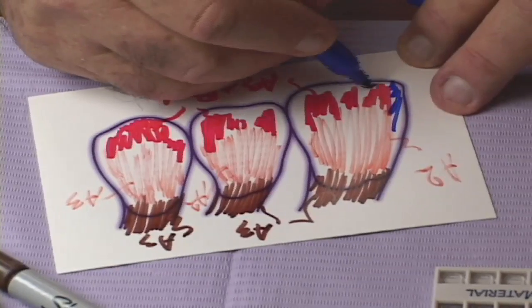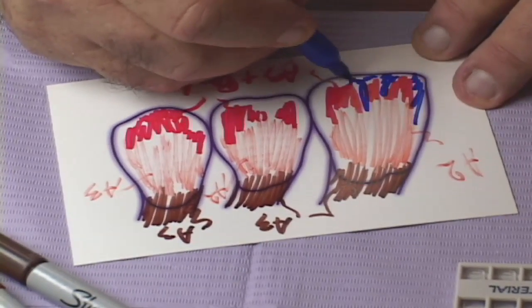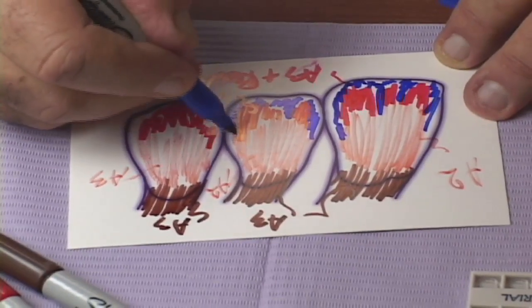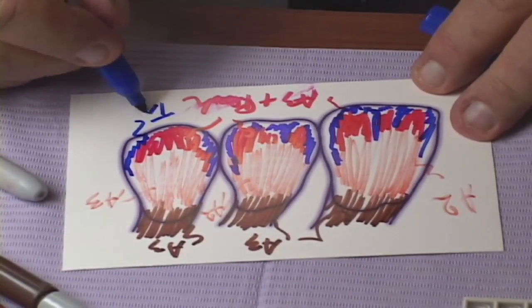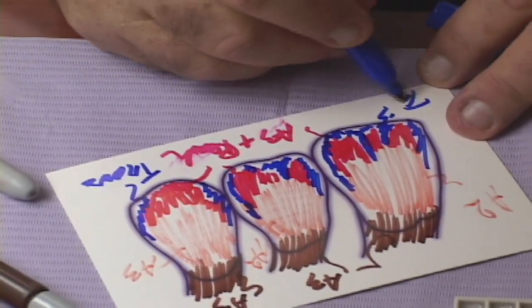Then the next thing to establish is translucency — what area of the tooth shows very vivid translucency. We mark those areas, and we can see that there is translucency between the incisal edge and the lobes. We mark it as translucency using the blue pen to represent translucency.